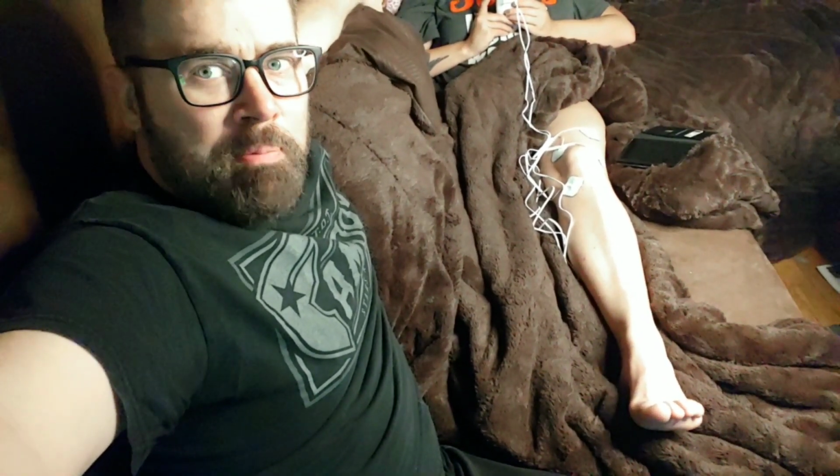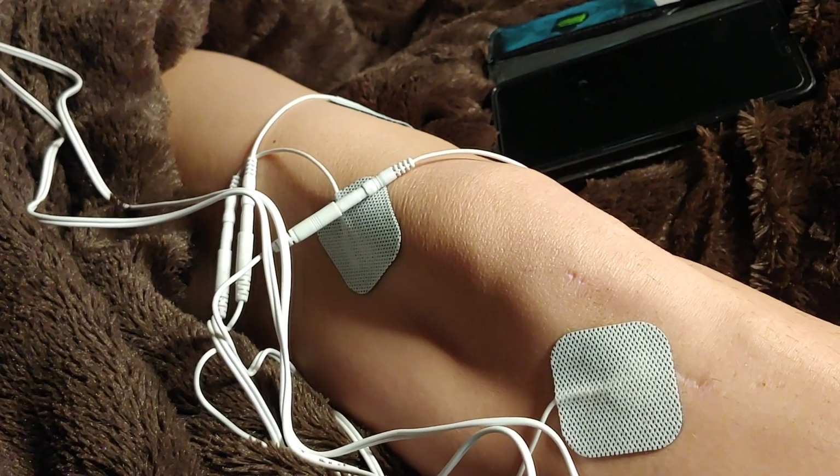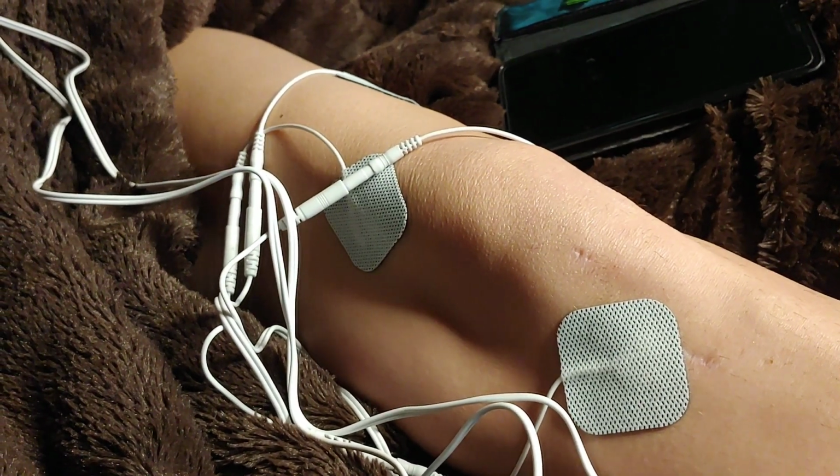Okay, so she's controlling it herself. And I think that controlling it yourself gives you a lot more tolerance. If someone else is doing something to you, it hurts more. But she seems to be able to turn it up higher when she does it herself. Does it hurt? No. She says it doesn't hurt, so hopefully this helps. Crank it to 10. Oh, gee, look at that. It's doing that on its own. Wow.